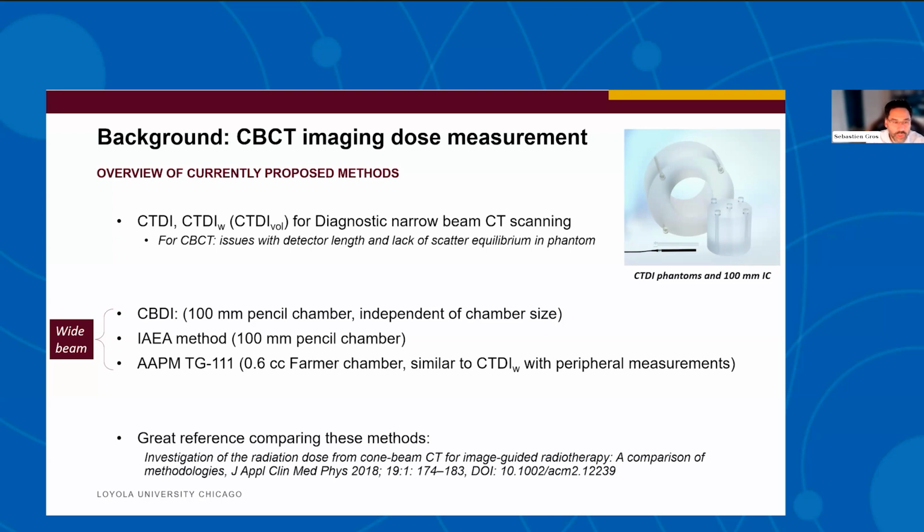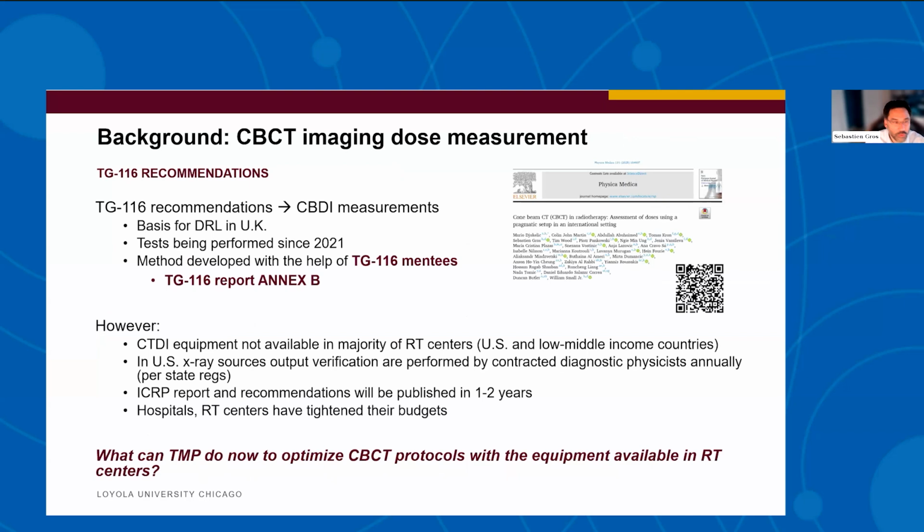So in terms of TG116 recommendations, we want to use CBDI for the moment. That was the basis for the study that Tim presented. And it's also the method that we've been working on as part of TG116 with a group of mentees.